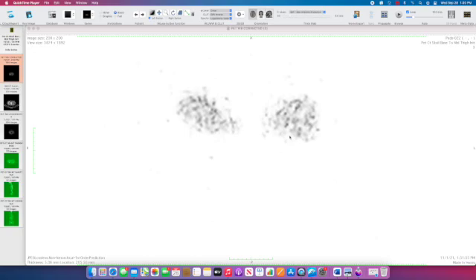So this software was not made for reviewing PET CT. We're just going to do the best with what we have here.